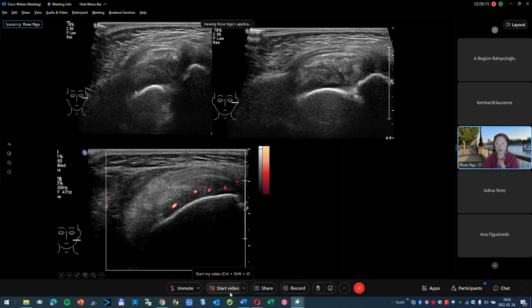Something is lifting it up from the mandible itself. Looks like there is a collection in here. It's an abscess. Where could it come from?